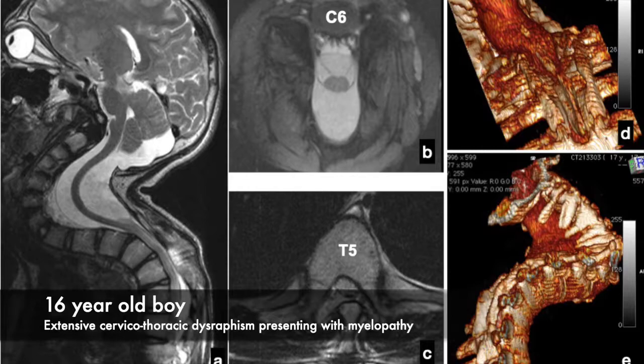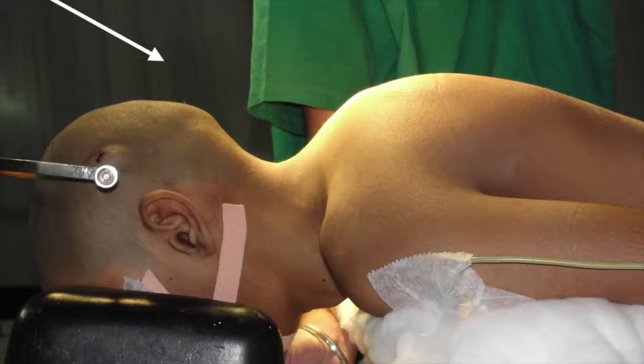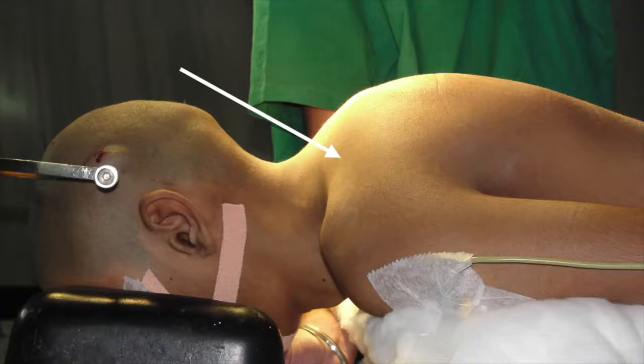The imaging studies did not reveal any spinal cord tethering. The patient was positioned prone on a horseshoe headrest with Gardner-Wells traction. In this position, the cervical hyperlordosis corrected partially, which allowed for upper thoracic pedicle screw trajectory.